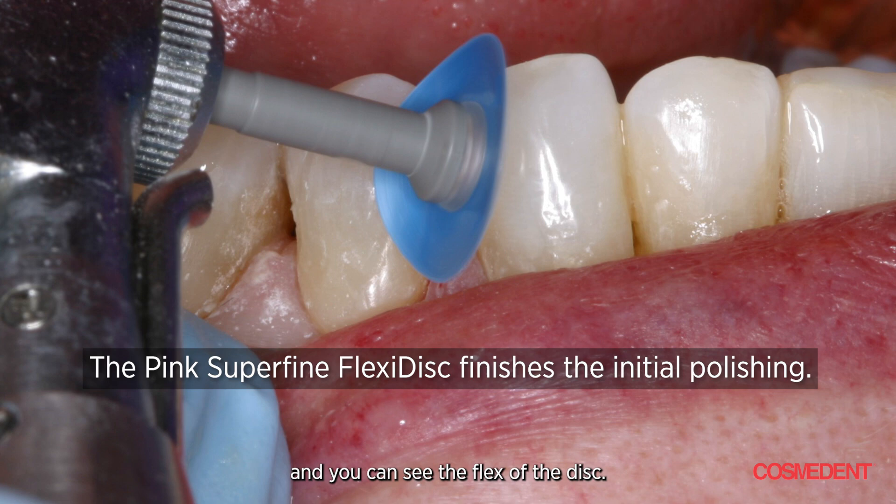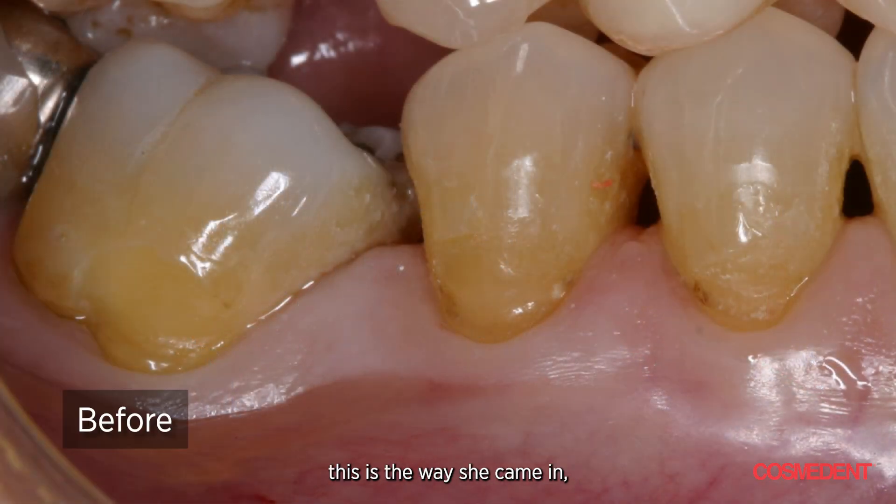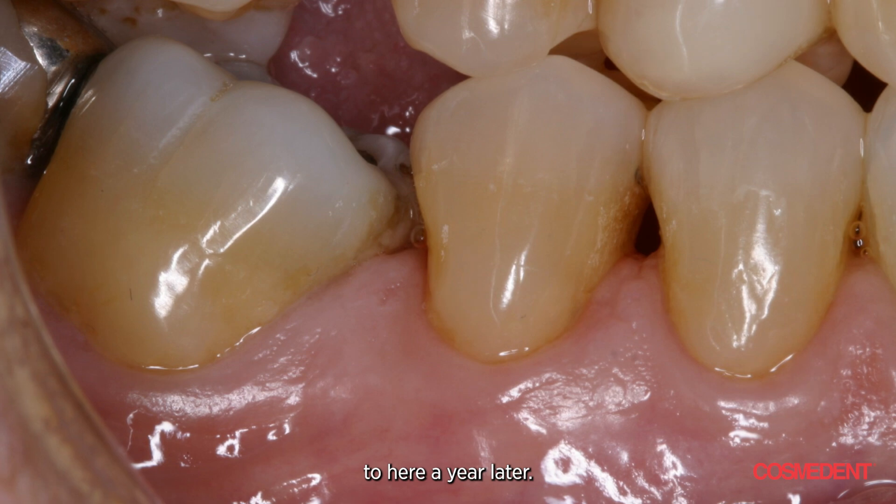Then we finish it with our polishing paste. So we go from the way she came in to here a year later — and you can see the tissue and how it responds.